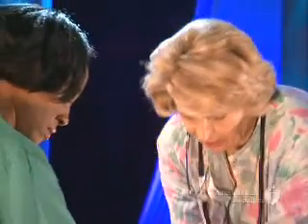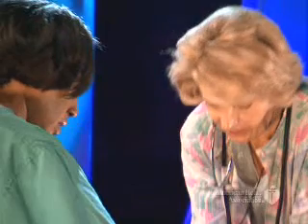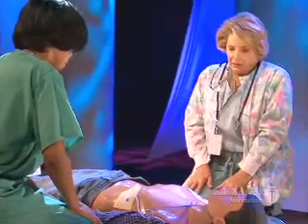Analyzing heart rhythm. Clear. If the AED finds a heart rhythm that could be treated with a shock, the AED will tell you so. Shock advised. Stay clear of patient. Deliver shock now. The AED will then tell you when to push the shock button.